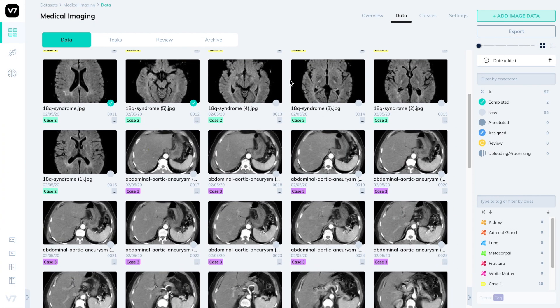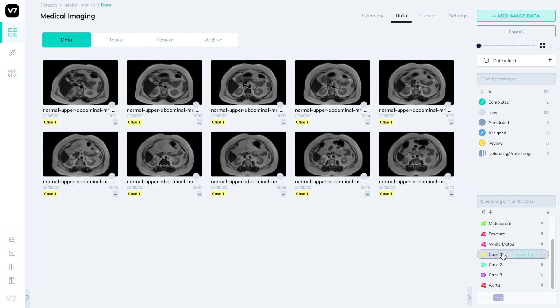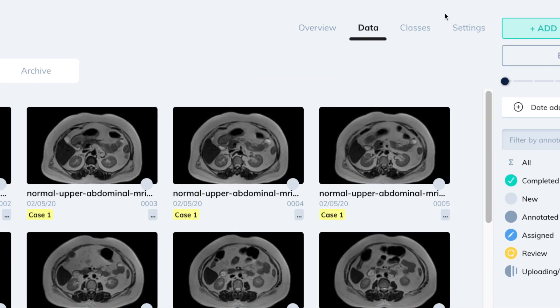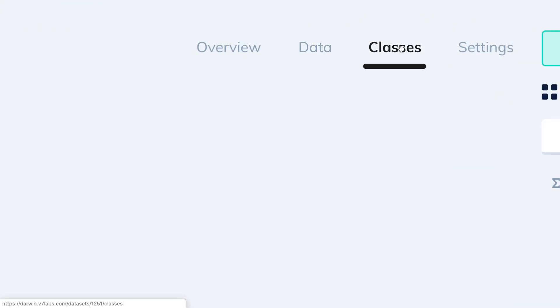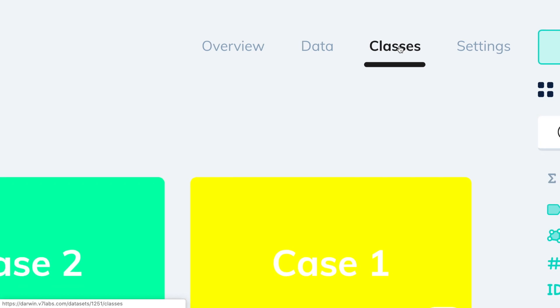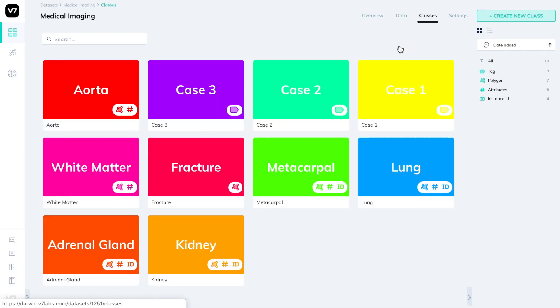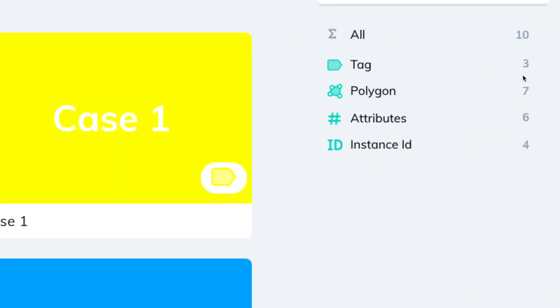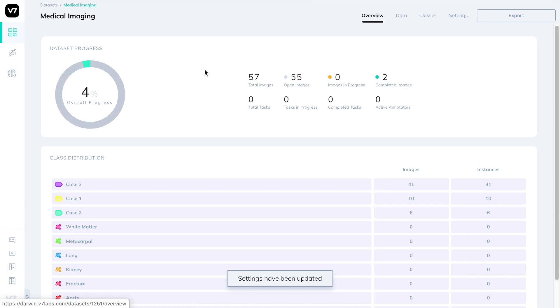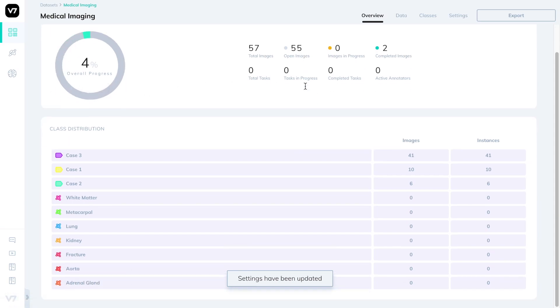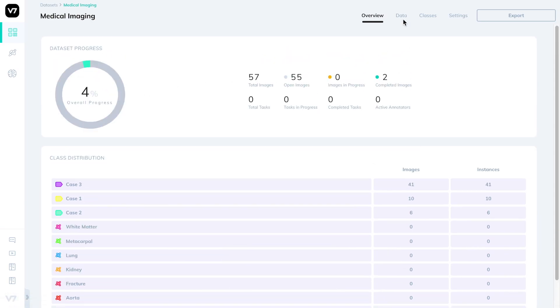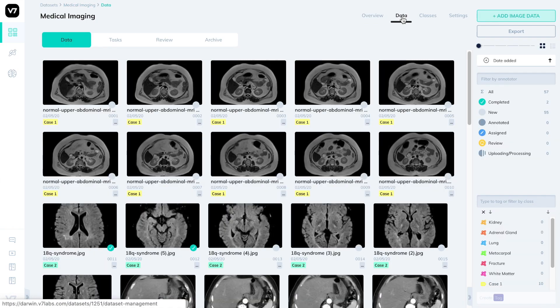Within this new dataset we'll be looking at three cases, and to browse them we can use the filtering options on the right. If we head over to the classes tab, we can see all the classes we've created, as well as an overview of all the annotation types available. In the overview tab, we'll see dataset progress and how frequent each class is within the dataset.